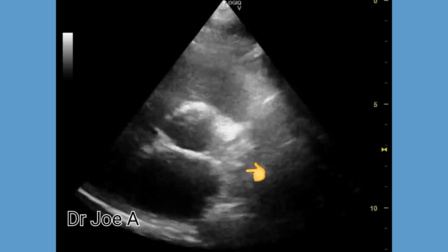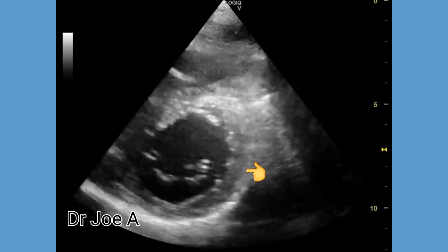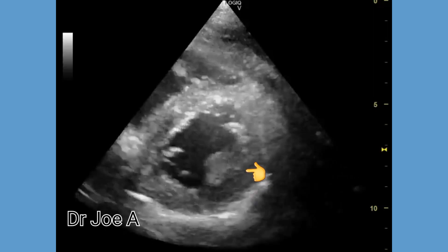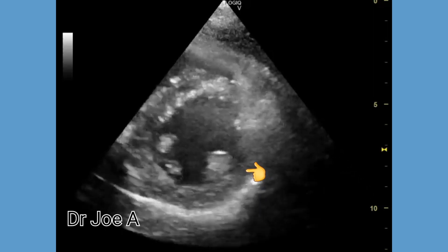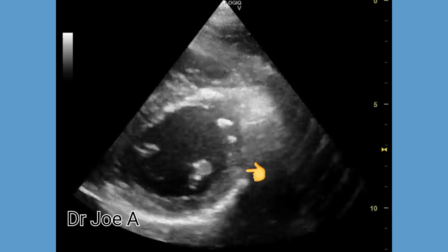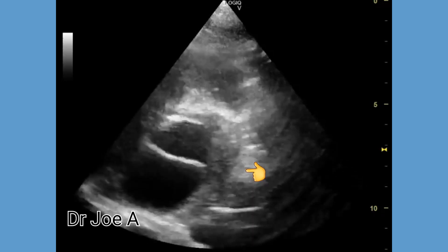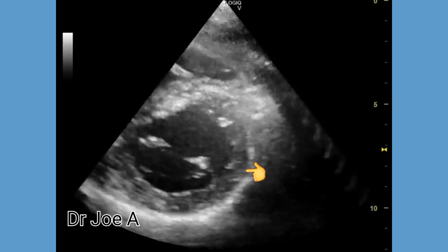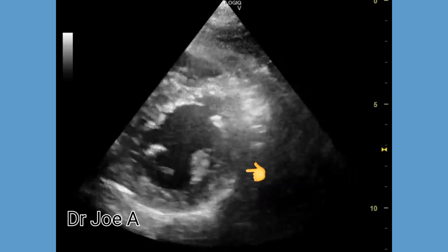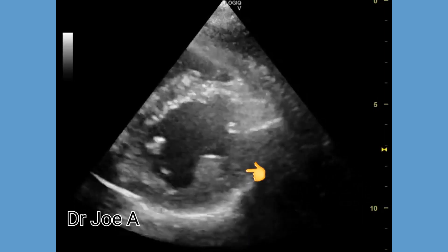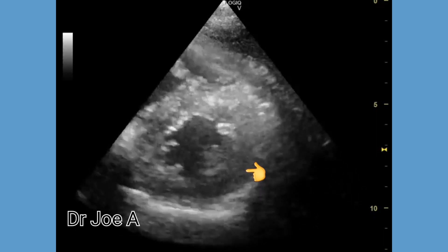In the short axis view, we can see the hypertrophied posteromedial papillary muscle. The mitral valve leaflets appear grossly normal. Isolated papillary muscle hypertrophy is very rare, and very little literature is available on this condition.